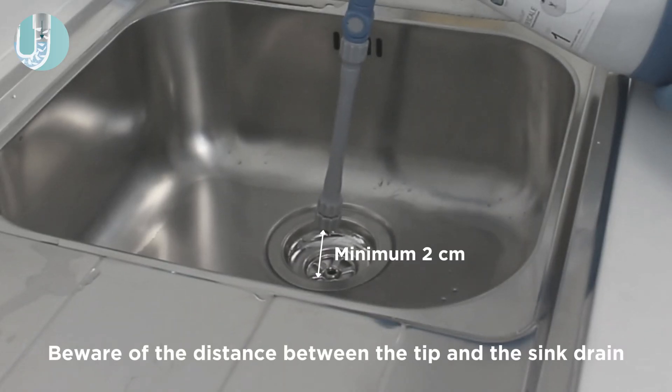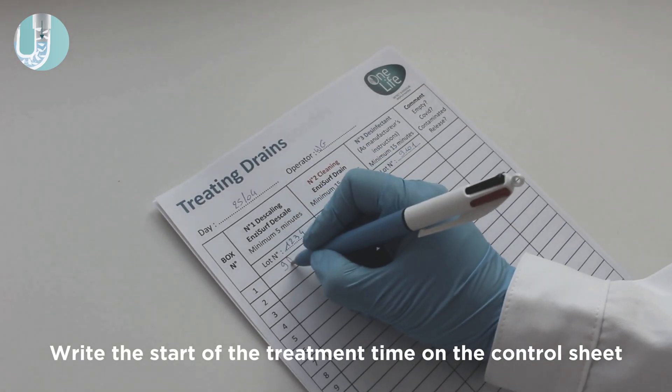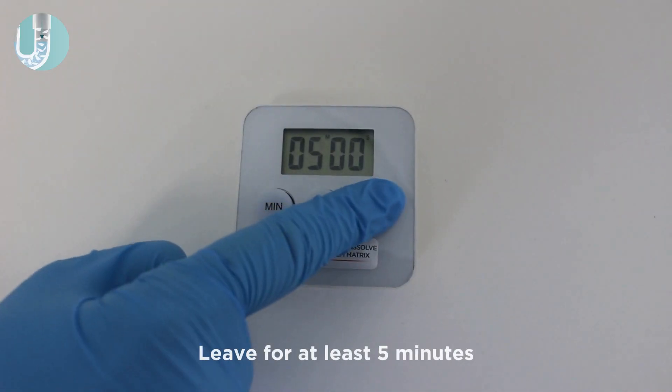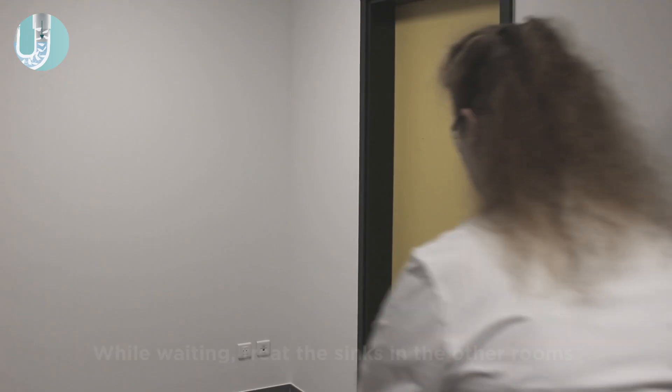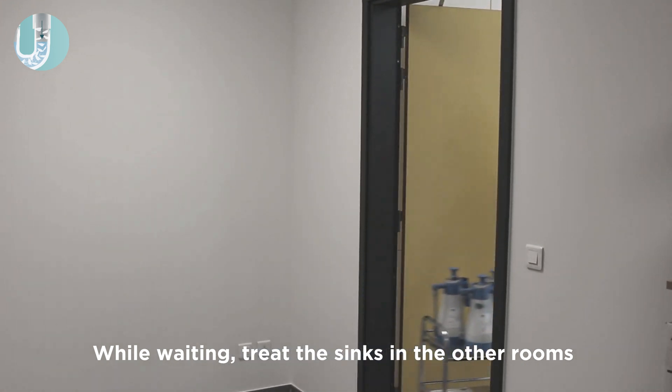Make sure to keep the tip of the sprayer two centimeters away from the sink drain to avoid carry-forward of contaminations. Write the start of the treatment time on the control sheet and leave for at least five minutes. While waiting for the treatment to have its effect, treat the sinks in the other rooms.